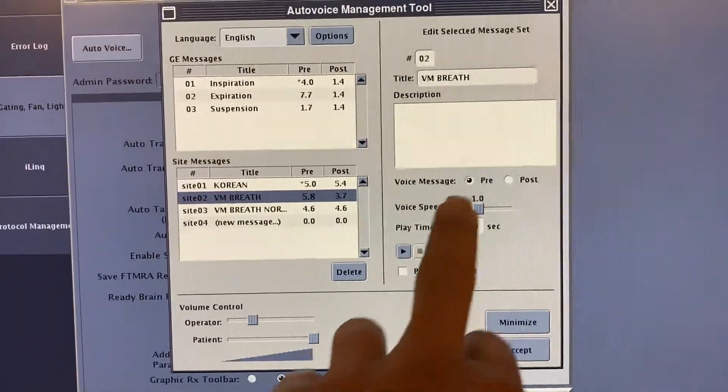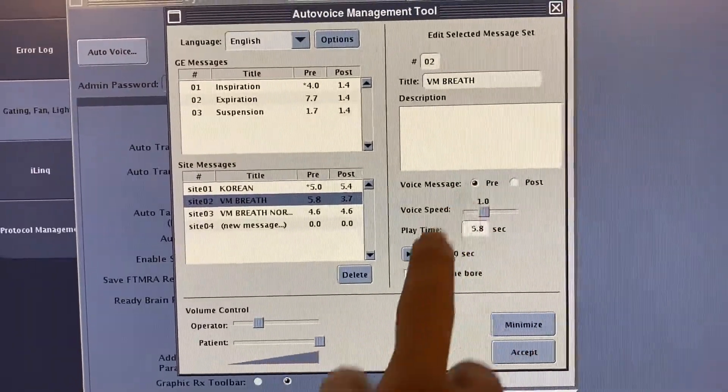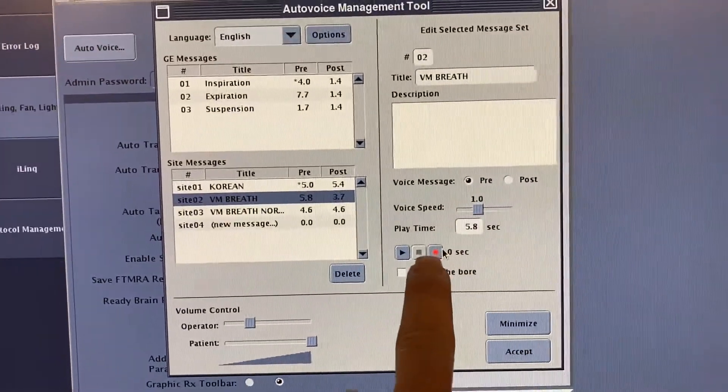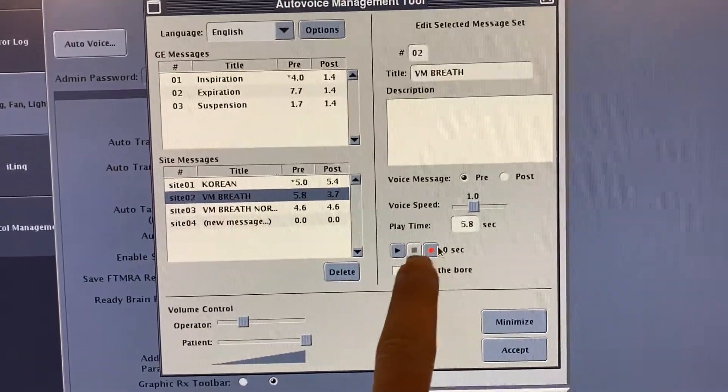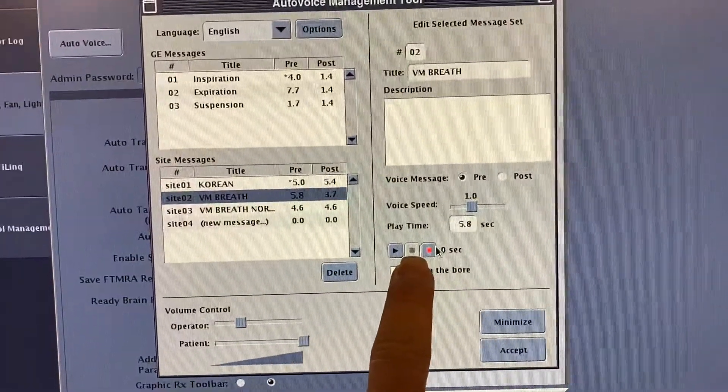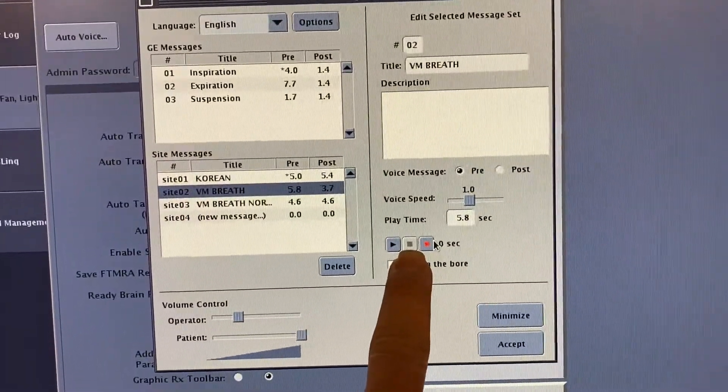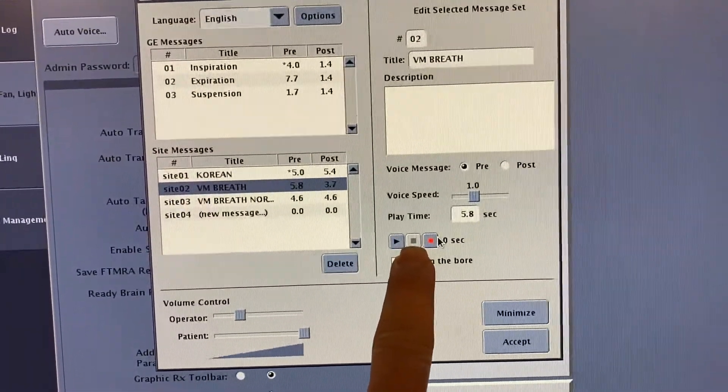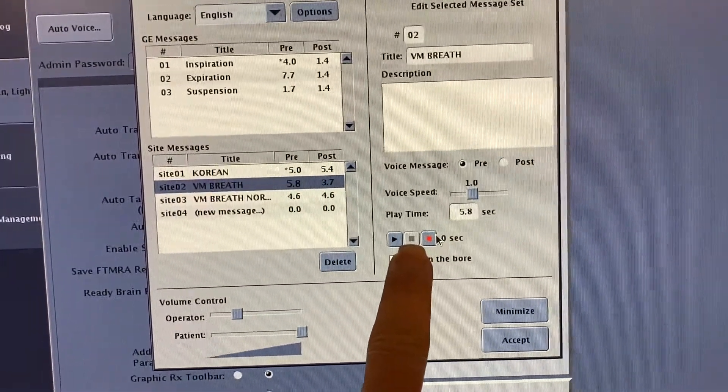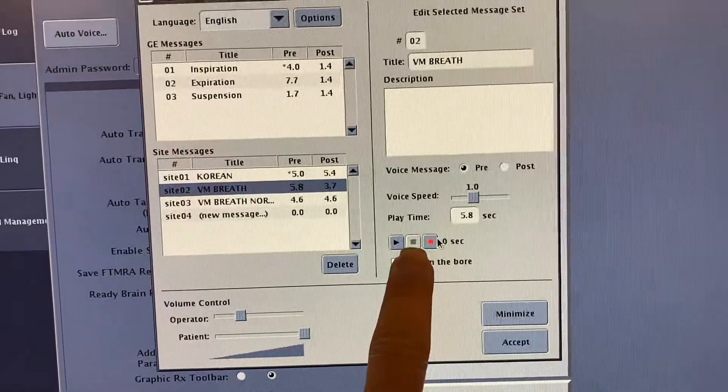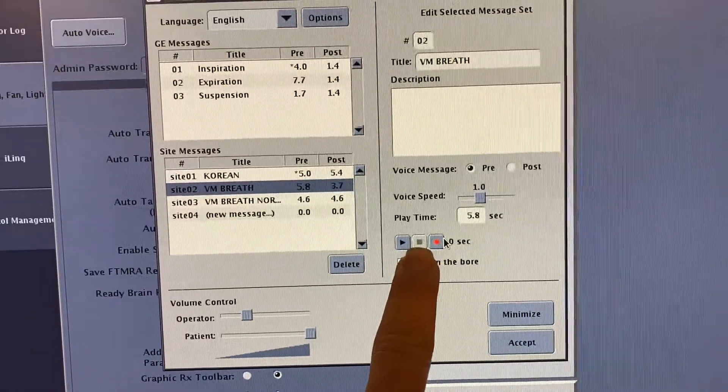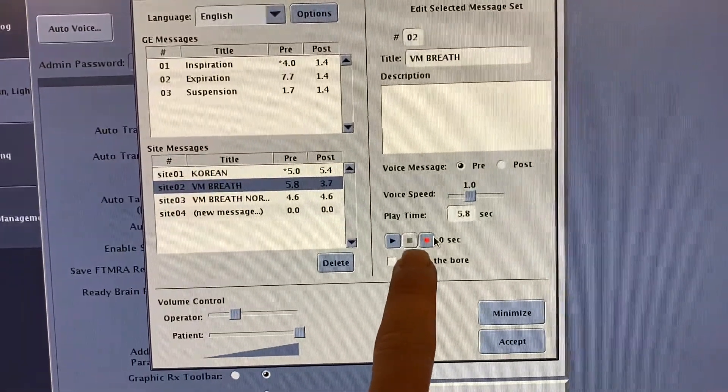Now that's for pre. For example, I recorded 'take a deep breath,' 'take a breath in,' 'hold your breath.' Afterwards, that's done.